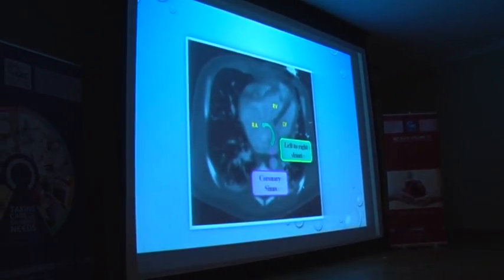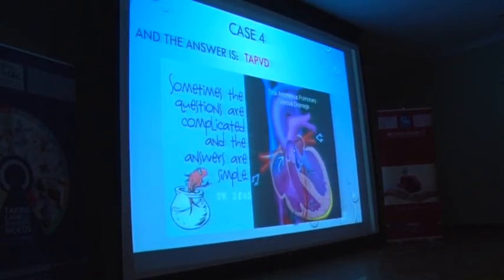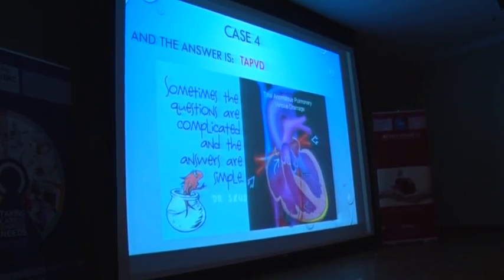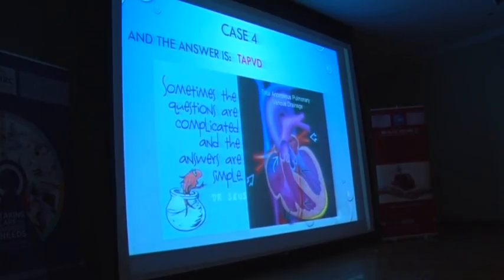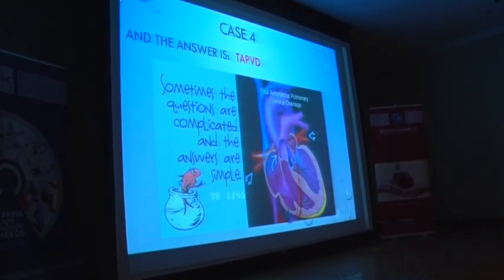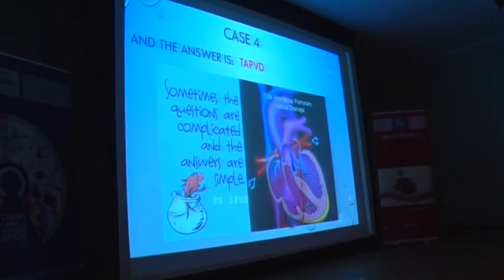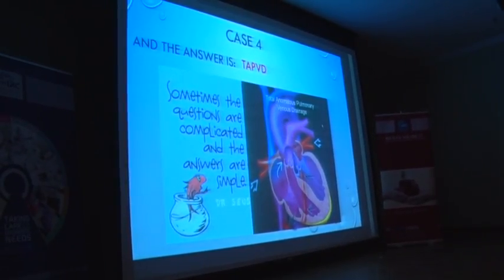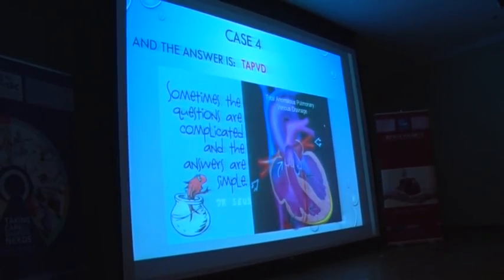I will show you a small diagram to explain you that. So this is the normal. This is the abnormal situation. Normally, the 4 pulmonary veins are entering within the left atrium, okay? But in this case, they all connected together via a big vein that entered the coronary sinus in this case, and we call it total anomalous pulmonary venous drainage. It's a complex case, but it's just to show you how, with an ECG-gated examination, we can detect very, very small anomalies. Excellent, doctor. Come with us. Thank you.